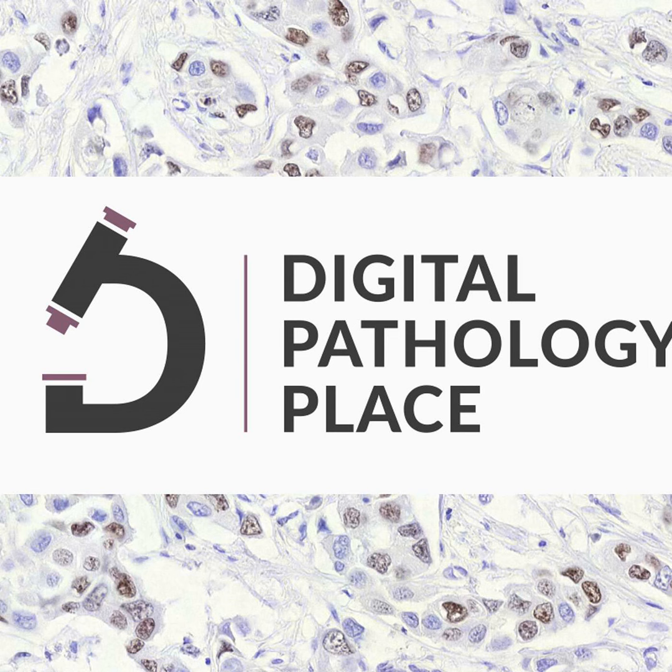Of course, you can visually look at the images and turn on and turn off all of the different signals in order to figure out what's going on in a particular piece of tissue, but this is going to be very slow. And you can take a manual approach if you'd like when the plex is low, but as the multiplex gets larger and larger, it's going to be really challenging and you're going to need computational assistance for sure.